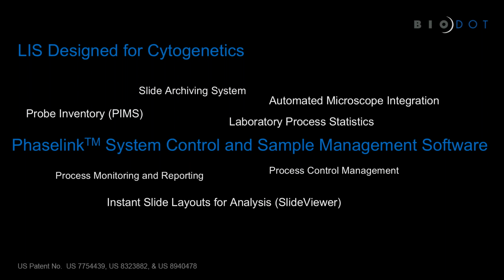Other aspects of the system or the software, we're basically a database. And so if you're curious about how many CLLs you did over a 6-month period, you can walk up to the system and type that in or query the system, and it will give you that answer in real time.